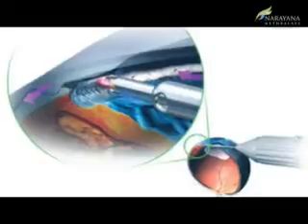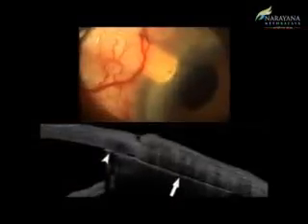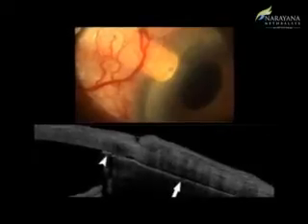Its use can be extended to micro-incision glaucoma surgeries, tube insertion in drainage device implantation, needling, non-penetrating glaucoma surgeries, and also as a teaching tool.